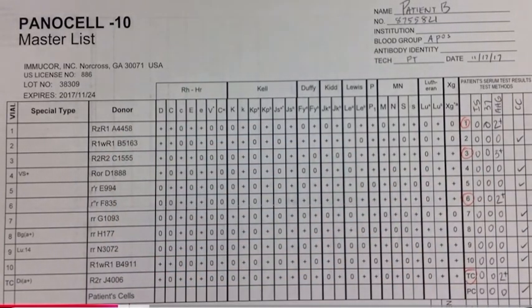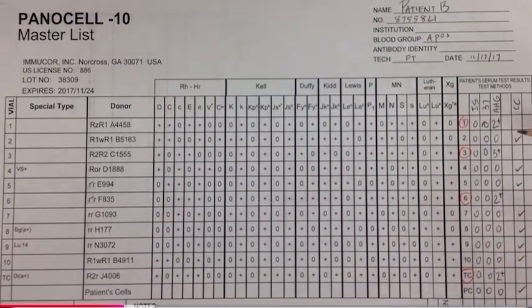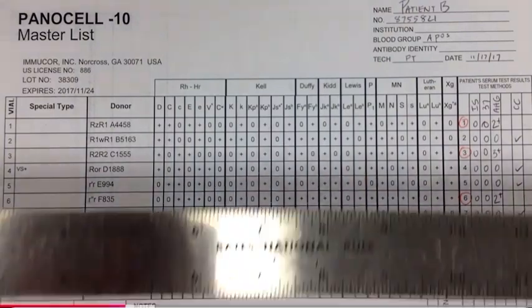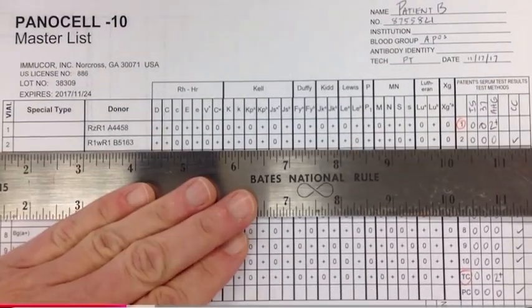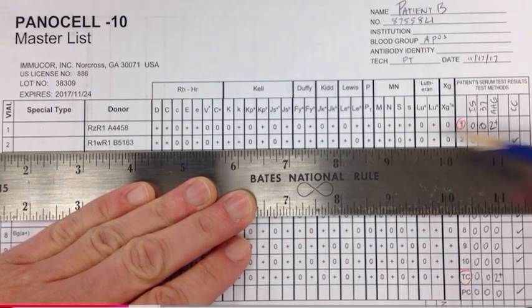So the TC cell. Okay, so as we did in my first video, we're going to go ahead and start ruling out. It would seem logical that we'd go to the positive ones and rule out the negative ones, but what we're going to do is go to the negative cells, the ones that have no reactions whatsoever, and we're going to rule out the positives here.